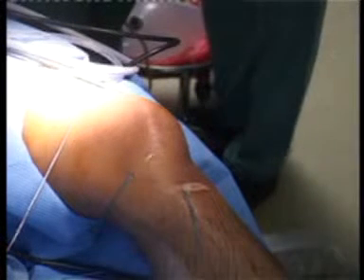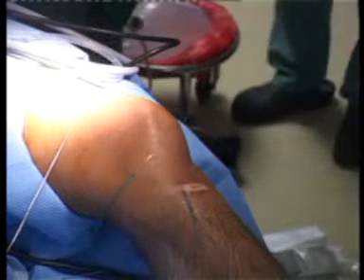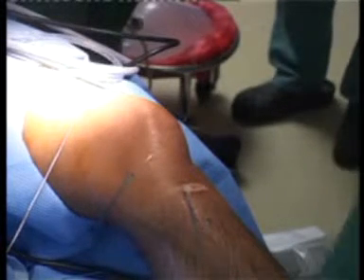Okay. Dr. Wolf, what are you doing next? You are passing the suture through the AM bundle now. That's it.